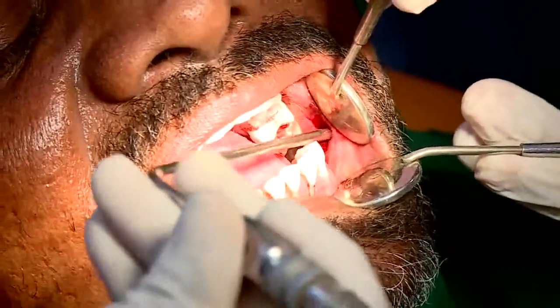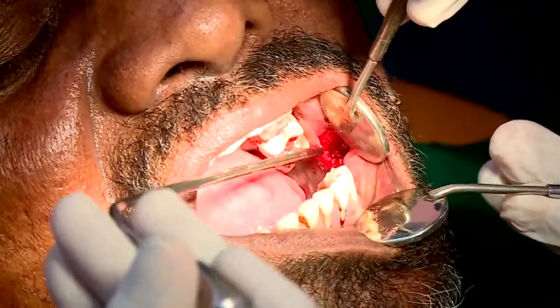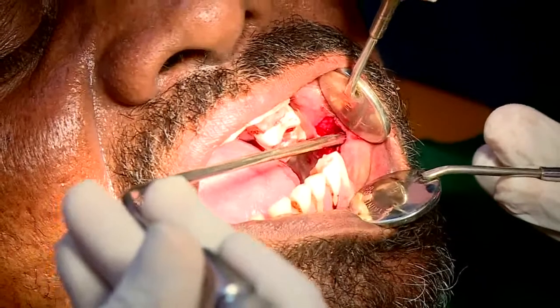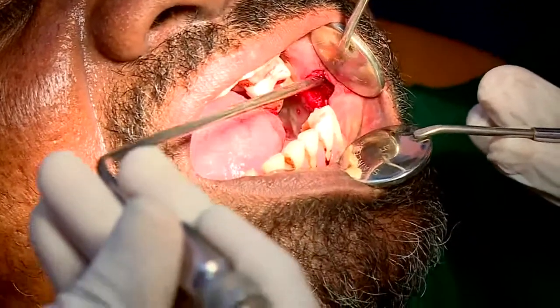The same size is visible. Is the depth of the lesion visible here? Depth of lesion is visible. Okay, so yes, that's the muscle layer. So mucosa and submucosa layer together.